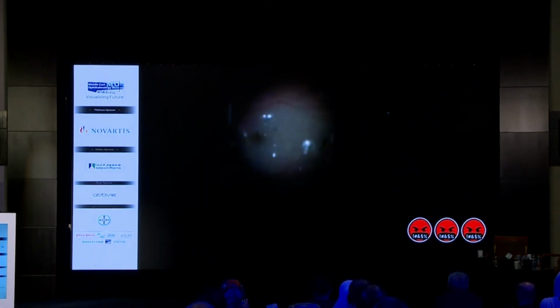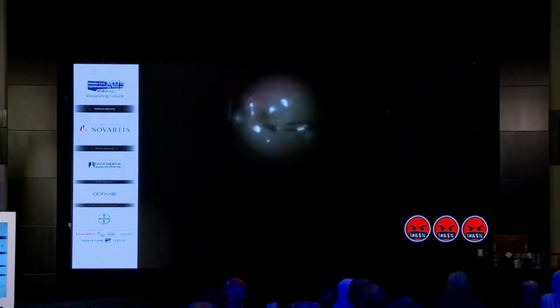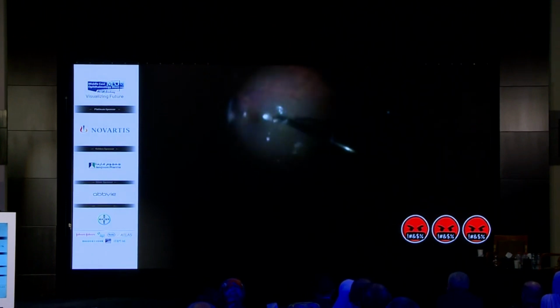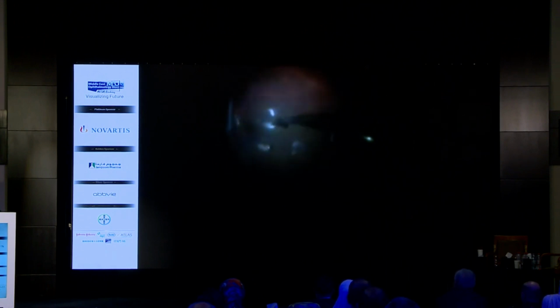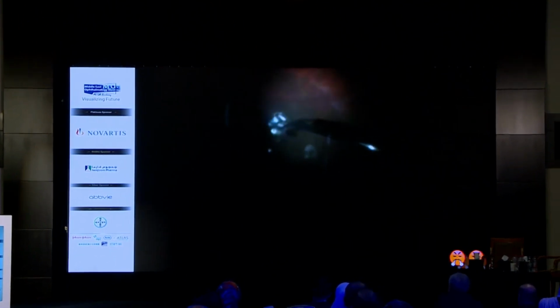It has fallen again. So angry and upset. Finally, yes, I got it, I got it out.